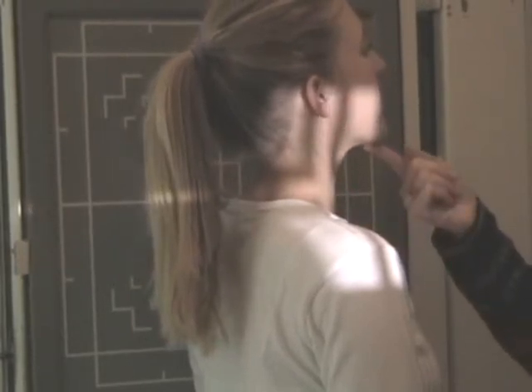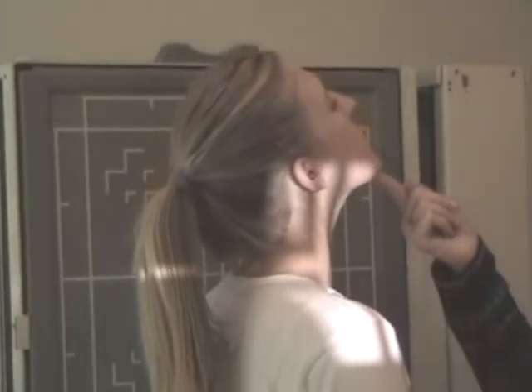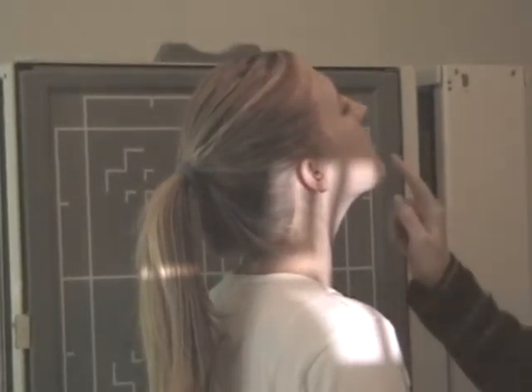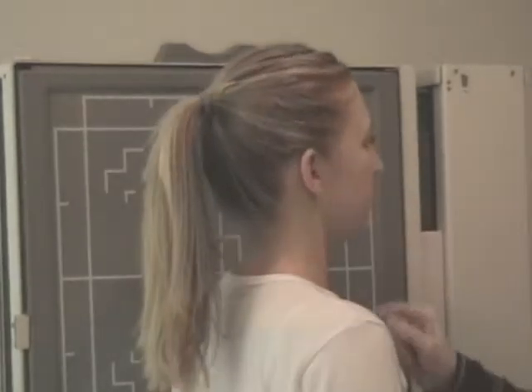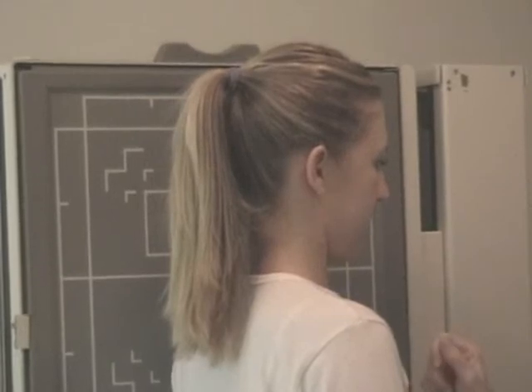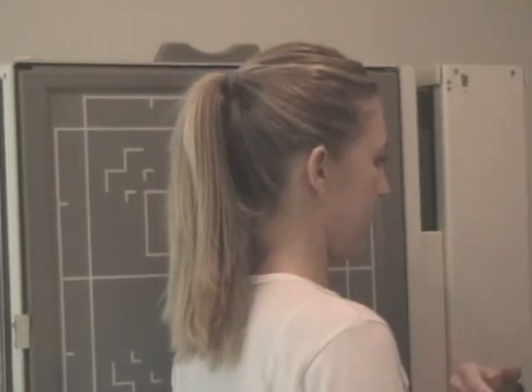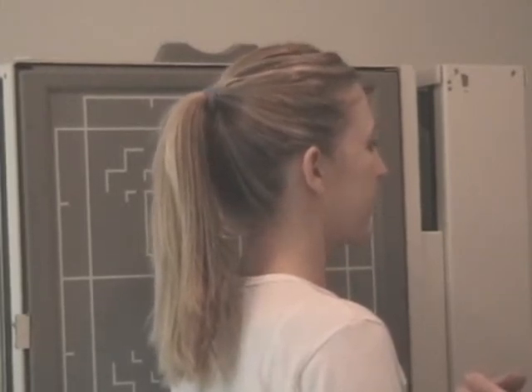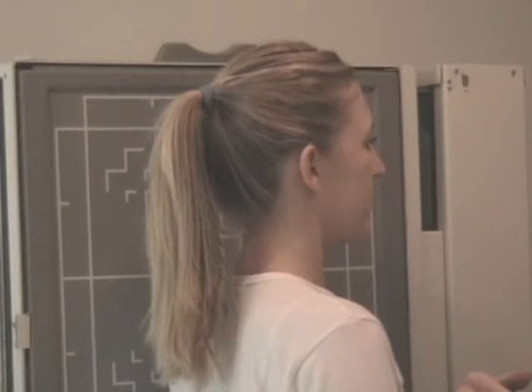Have the patient elevate their chin, not too much. You don't want them looking way up. That would be called an extension. And if they're looking down, this would be called a flexion. Now, sometimes you will do flexion and extension positions. They would be just like what I'm demonstrating here, but you would have the patient really extend or flex. That would be checking for mobility reasons.